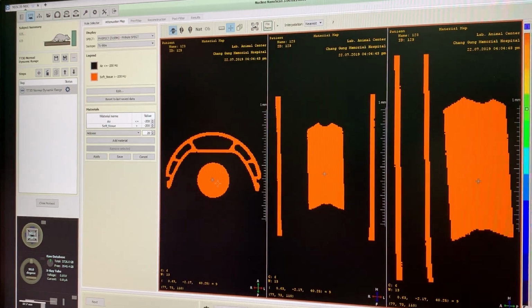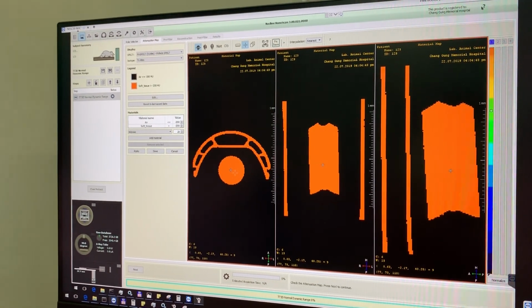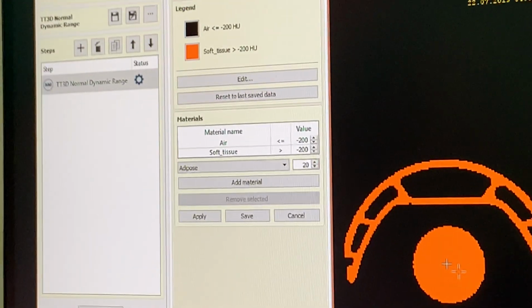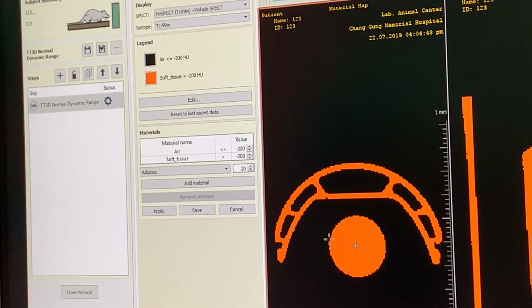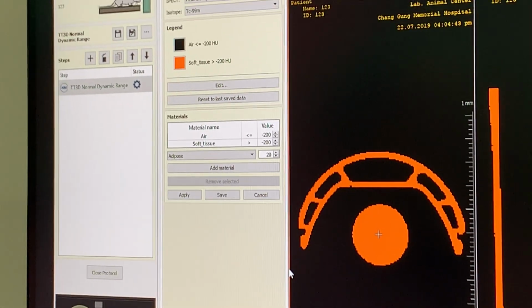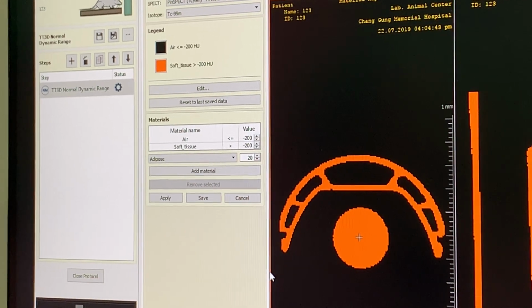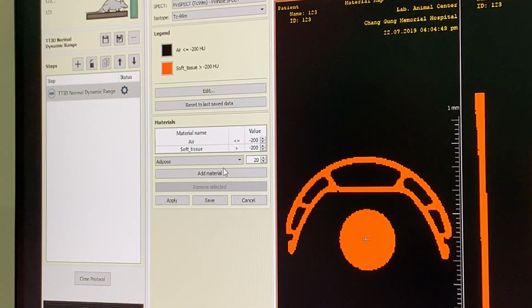If you add to the system that it is a separate material with a really high Hounsfield unit, it will really improve the image quality, so there will be no distortion. But I think only cases like this need an advanced material map.